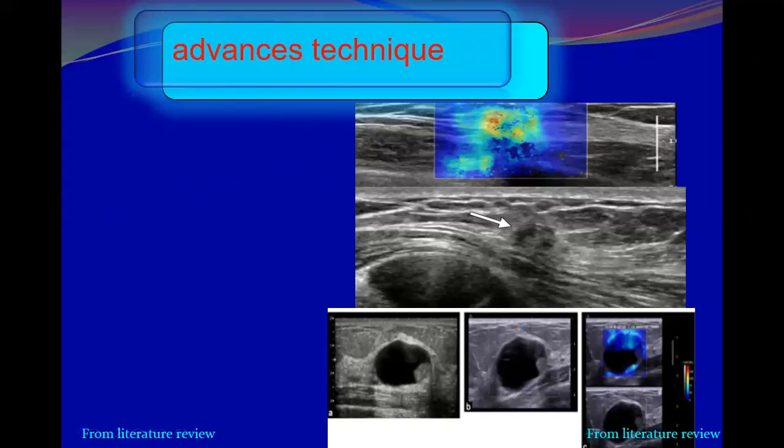Okay. It is soft. Even the nodule is completely soft. So that means this most likely will be nonspecific secretion or benign lesions. You see? But why here is there no signal? There is signal void here.